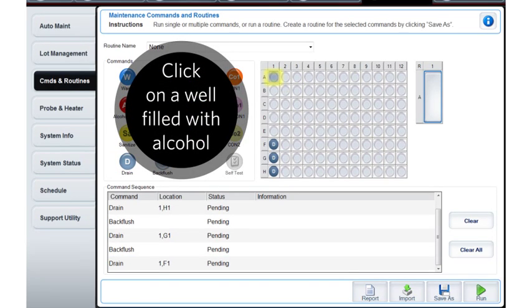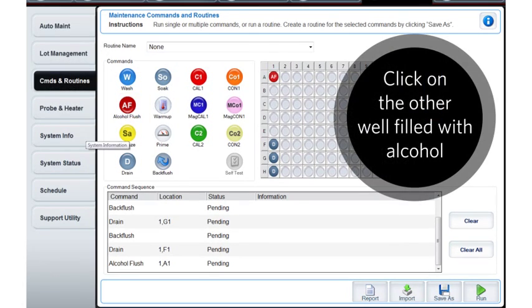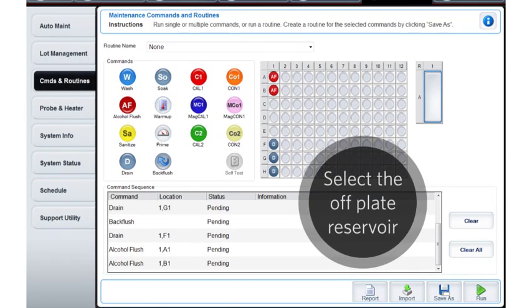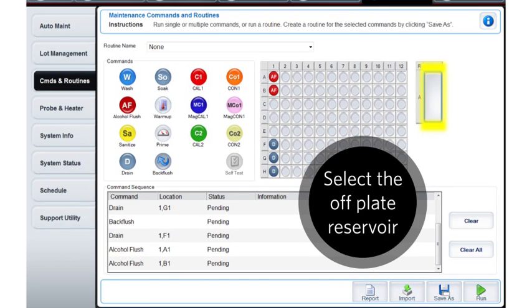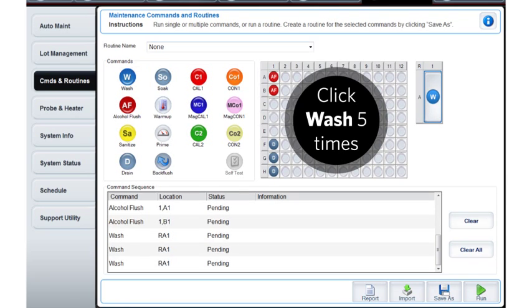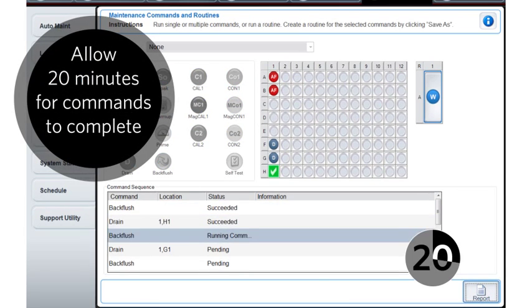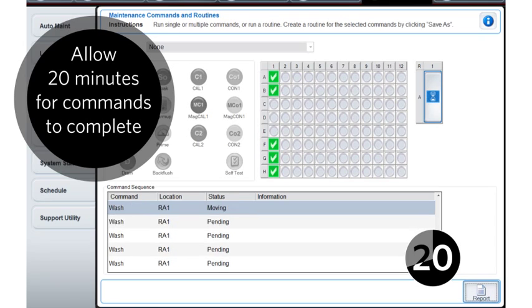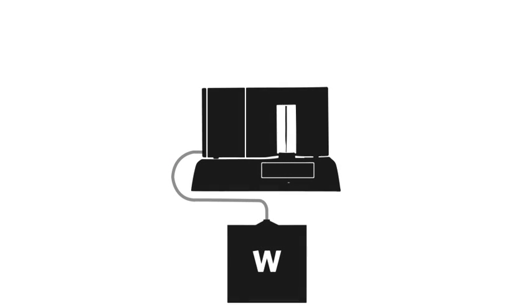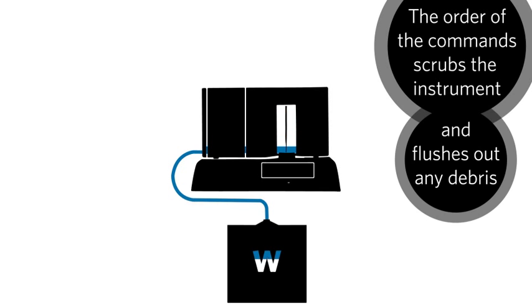On the plate layout, click on one of the wells filled with alcohol, then click the Alcohol Flush command. Click on the other well filled with alcohol and click on the Alcohol Flush command again. After that, click on the off-plate reservoir, then the Wash command five times. Finally, click Run. Click OK. The order of these routines creates a scrubbing effect inside the instrument, and any remaining residue will be flushed from the instrument.